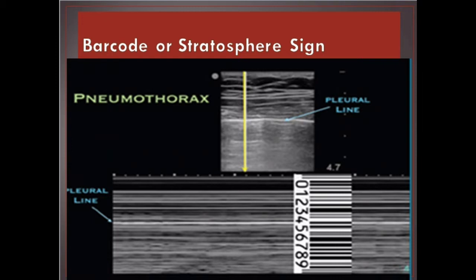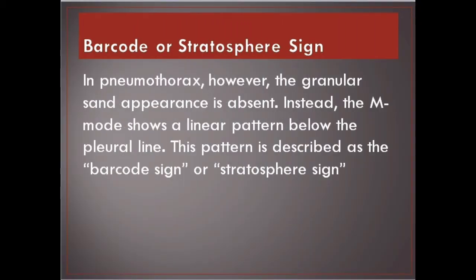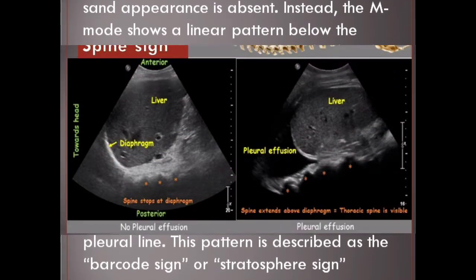Barcode or stratosphere sign. In pneumothorax, however, the granular sand appearance is absent. Instead, the M-mode shows a linear pattern below the pleural line. This pattern is described as the barcode sign or stratosphere sign.